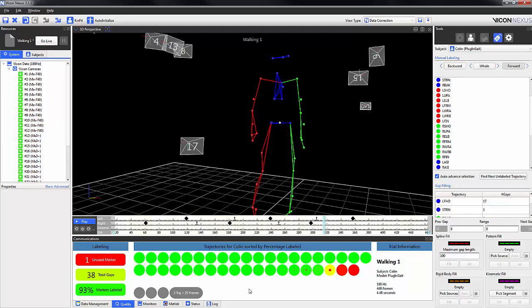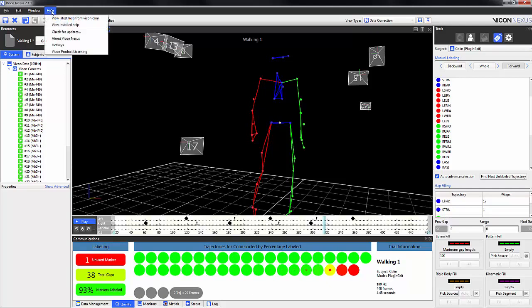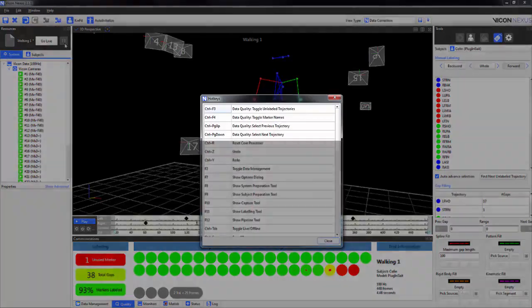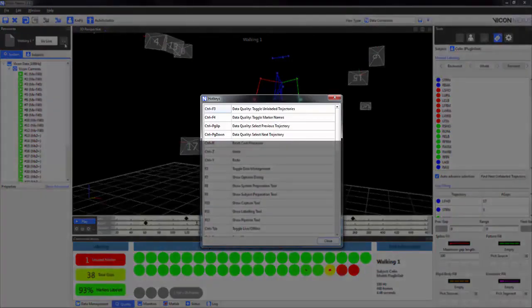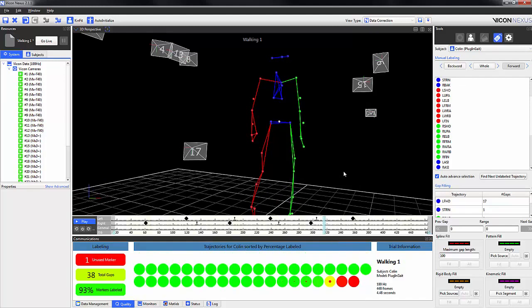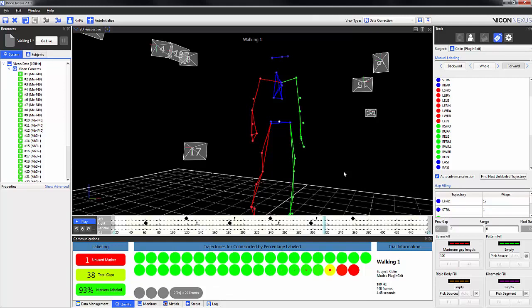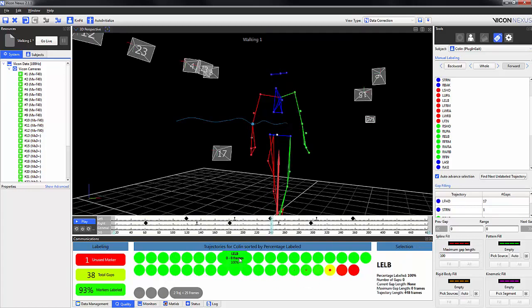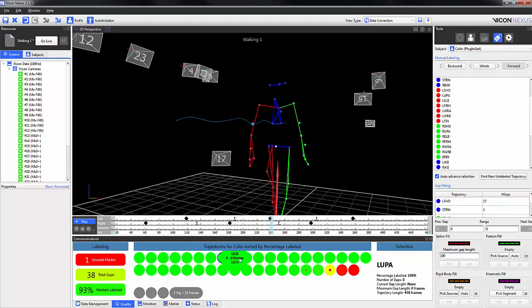The size of the red dot in the middle of the marker represents the size of the largest gap in the trial. You can also use the following hotkeys, which are found by going to Help, Hotkeys button. The hotkeys are Control F3, which will toggle the unlabeled trajectories on and off. Control F4 will toggle the marker names on and off. And Control Page Up and Page Down will toggle to the previous and the next marker respectively.